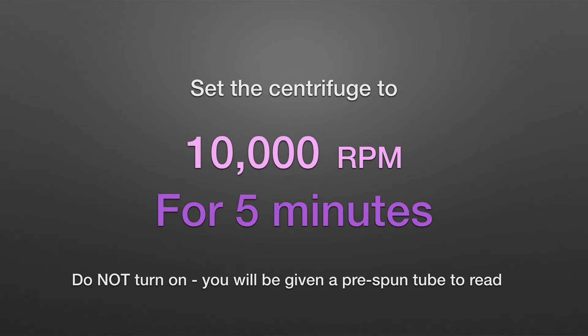Set the centrifuge to 10,000 rpm for five minutes, but do not turn it on. You're going to be given a pre-spun tube to read. 10,000 for five.